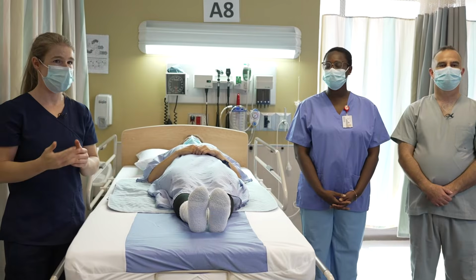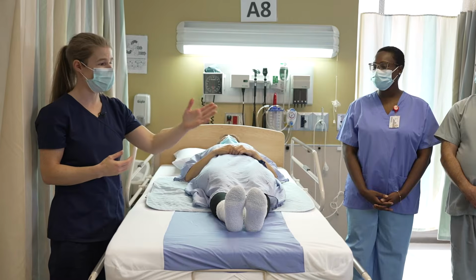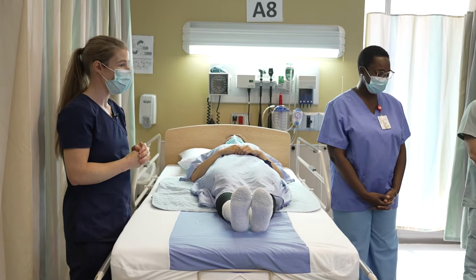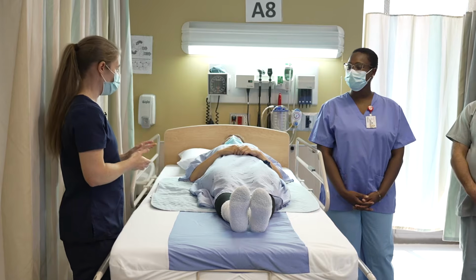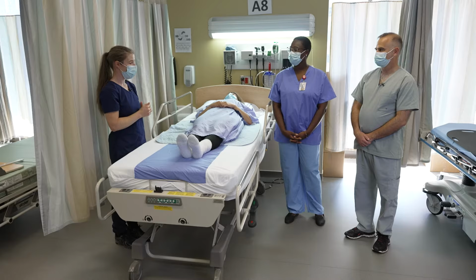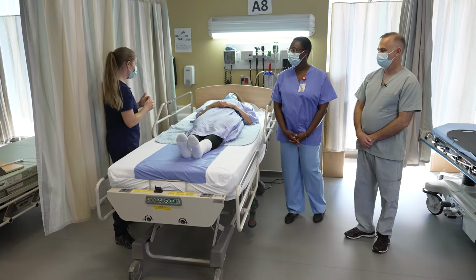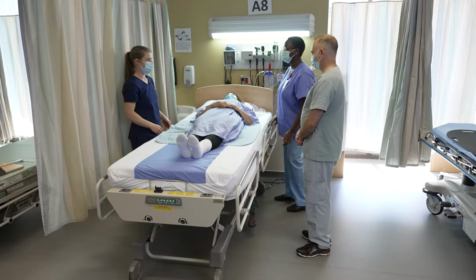So the first step of this technique is to make sure that we're familiar with our equipment. We have our stretcher ready to go on the side, we have a transfer board, and we have a patient that's already lying in her bed. So the first step is going to be to bring her closer to the side of the bed where we're going to transfer her. So we're going to start by lowering the side rail.